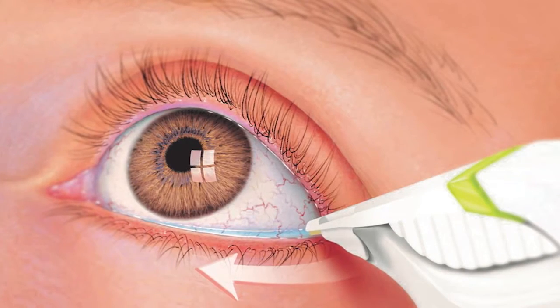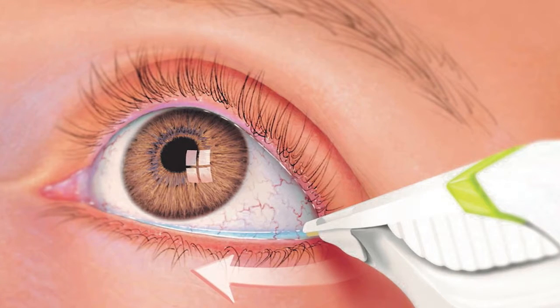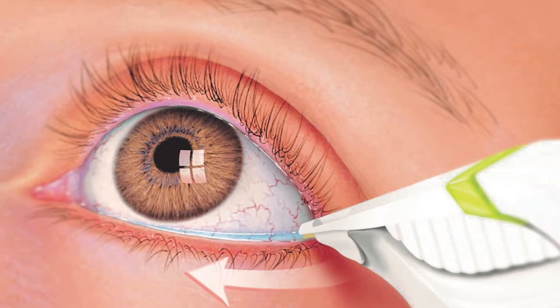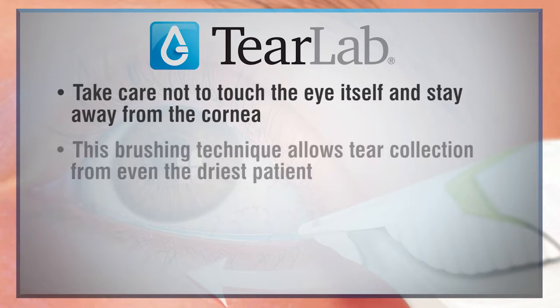If you still do not get a collection, do not remove the test card, but slightly brush the test card laterally along the eyelid just one to two millimeters left and right. Take care not to touch the eye itself and stay away from the cornea. This brushing technique allows tear collection from even the driest patients.